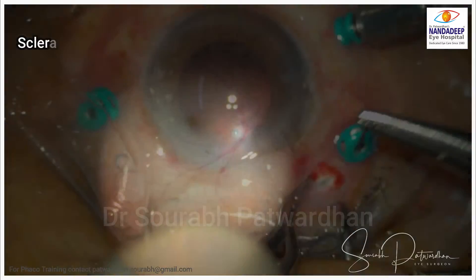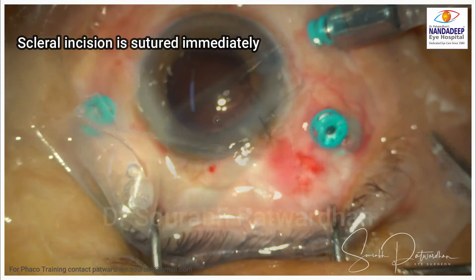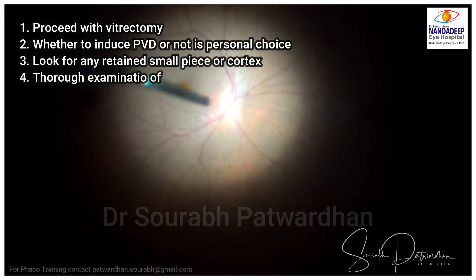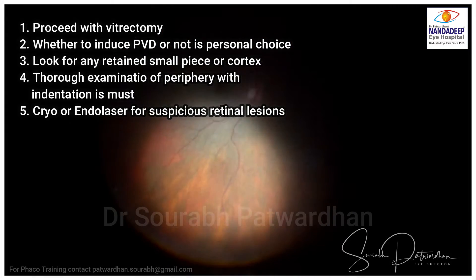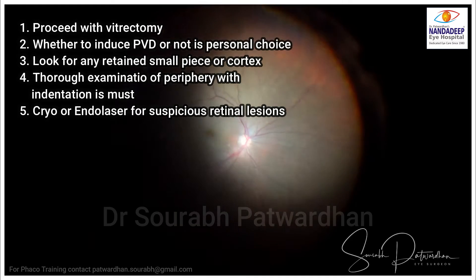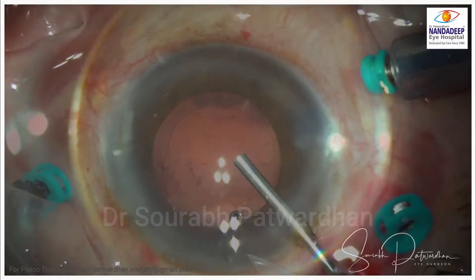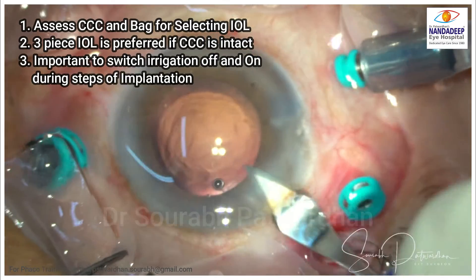Immediately after this, the scleral incision is sutured so that we again have a watertight vitreous chamber, and then proceed with vitrectomy. Whether to induce PVD or not is a personal choice — both have pros and cons. If PVD is already there, complete it. If not, I generally watch for peripheral lesions and do endolaser or cryo. Some surgeons plan PVD in all cases to prevent future PVD-induced breaks, but it may prolong surgical duration and can itself cause breaks.